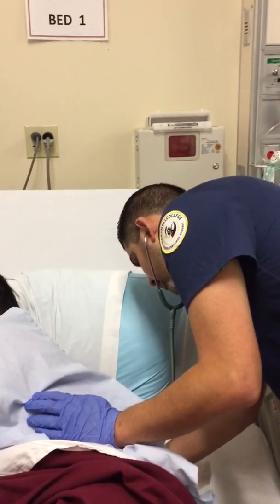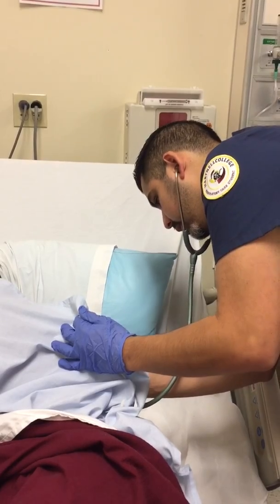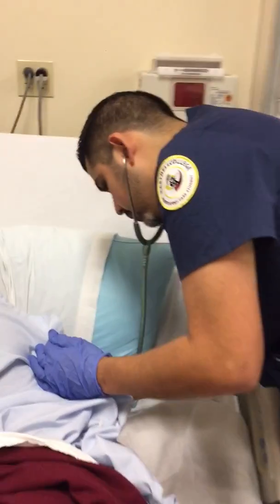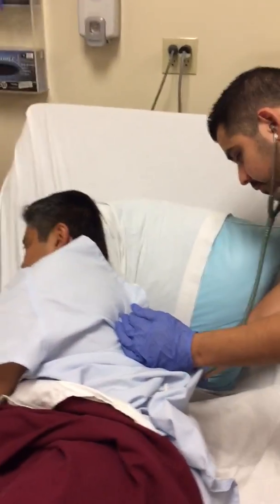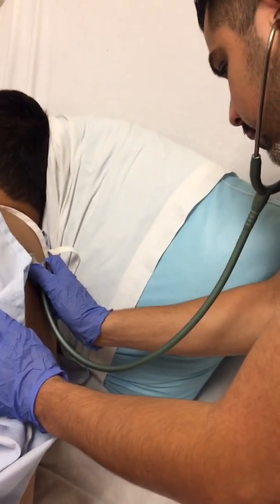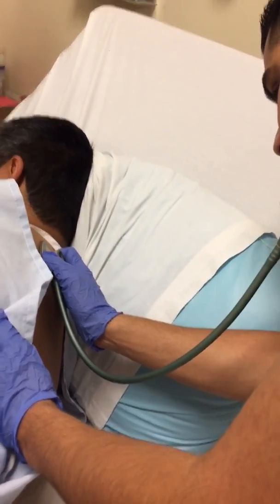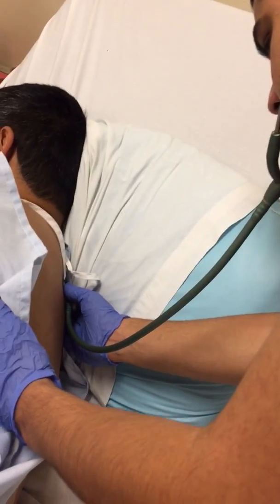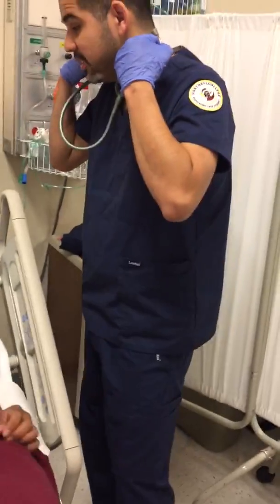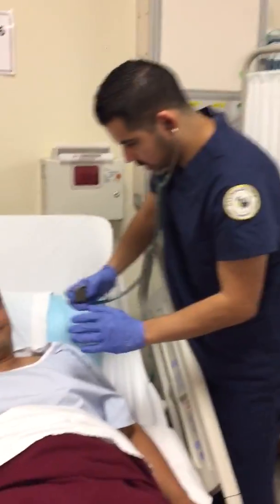Go ahead, take a breath. Okay. All right, good. I'm not hearing any wheezing anymore. That's pretty good. It means the drug has been working and it's taking effect. Now I'm gonna do your gown in the front again.